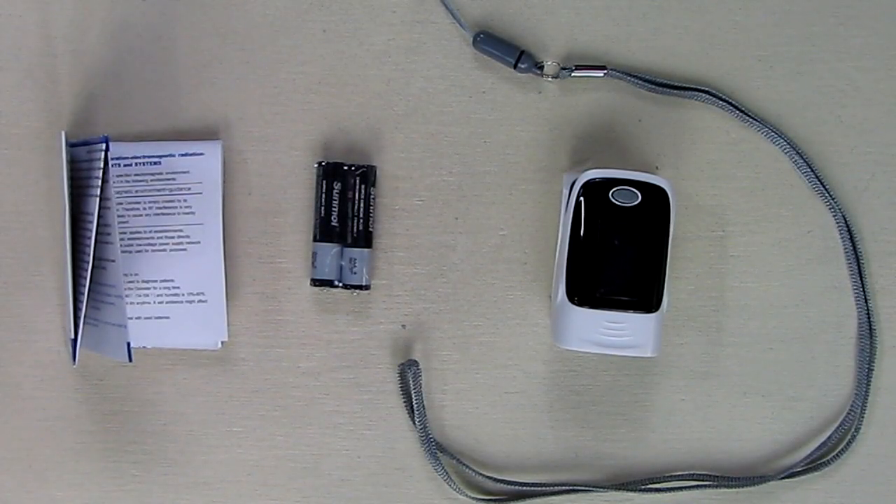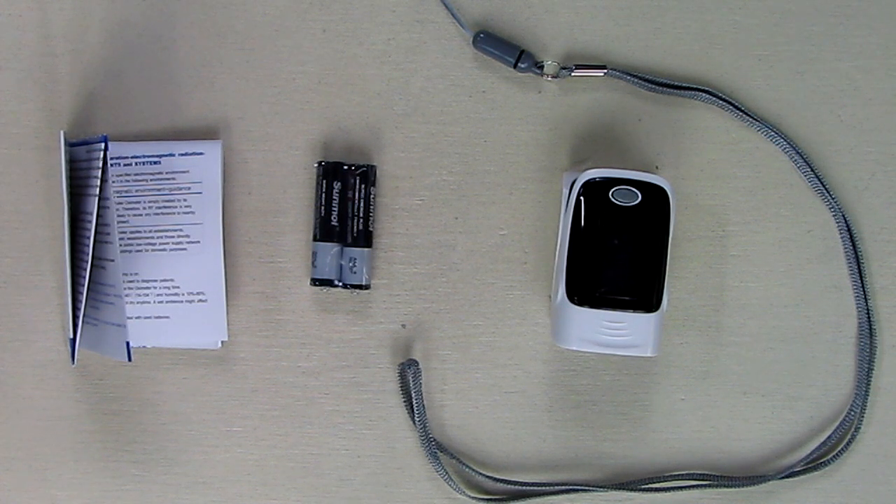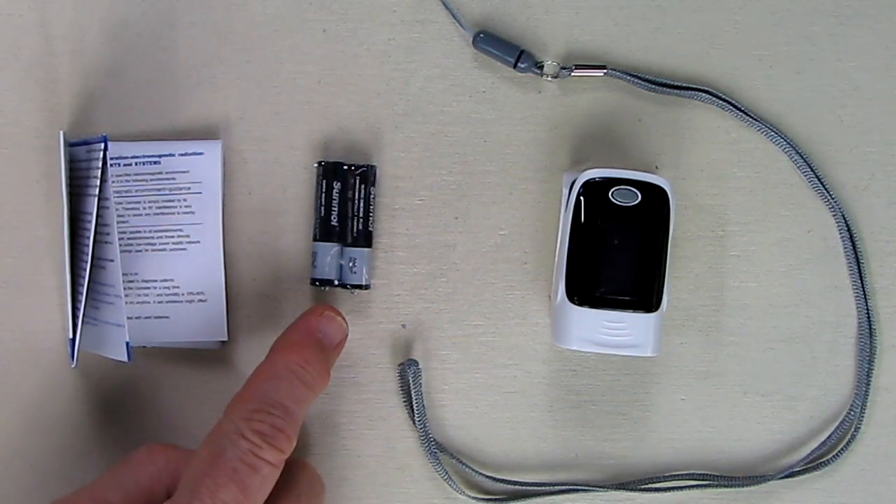Hello again, this is Robert Veach and this is my video review of a pulse oximeter. This is sold by a company called PRIDEAL on amazon.com. It measures your blood oxygen levels, which typically should be between 90 and 100 percent. It also measures your pulse rate. This is FDA approved and it uses two AAA batteries, which are included in this kit.